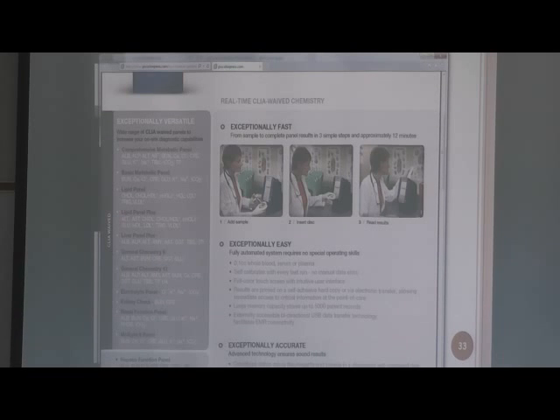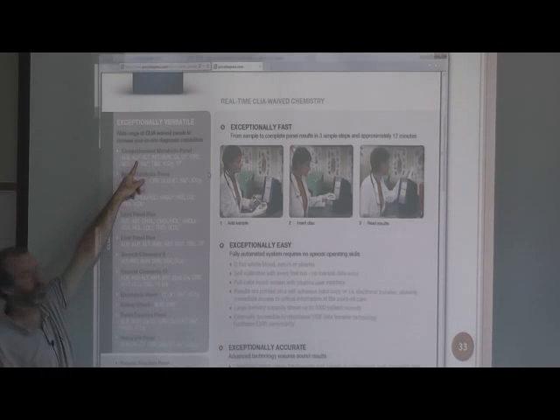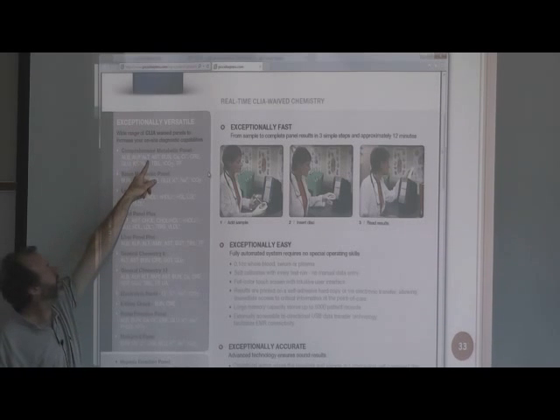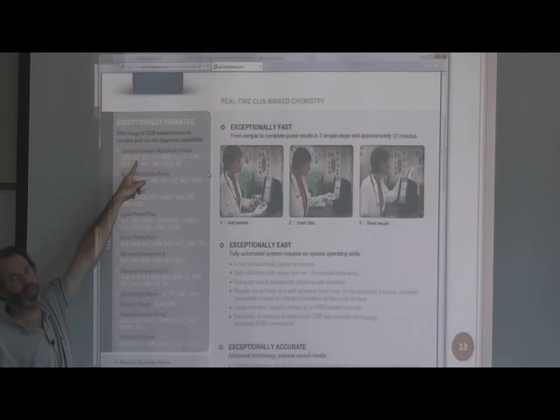They have this comprehensive metabolic panel where they test for ALB. What do you think that is? Albumin, ALP? I think we're going to do an ALP test this semester. ALT? ALP is alkaline phosphatase, right?